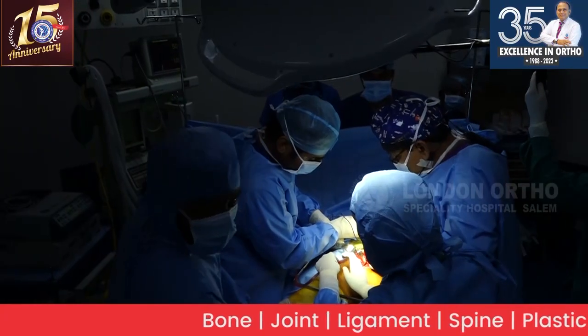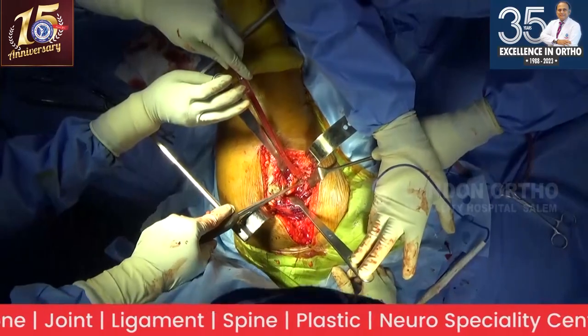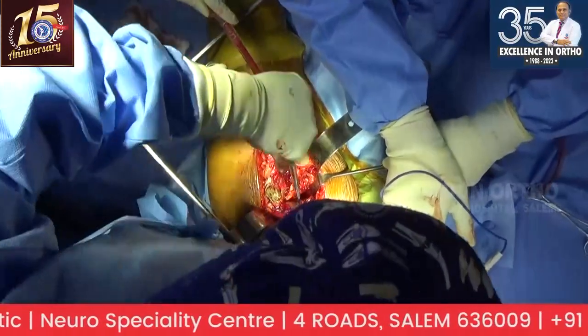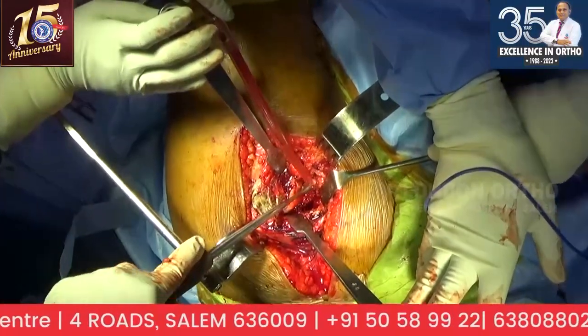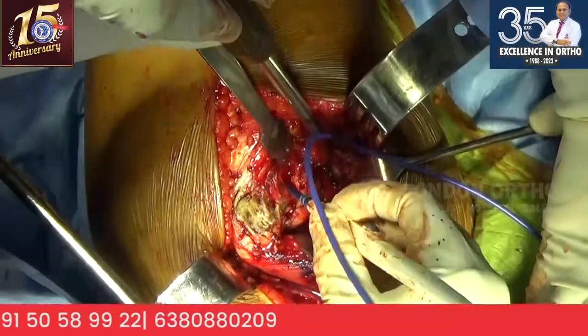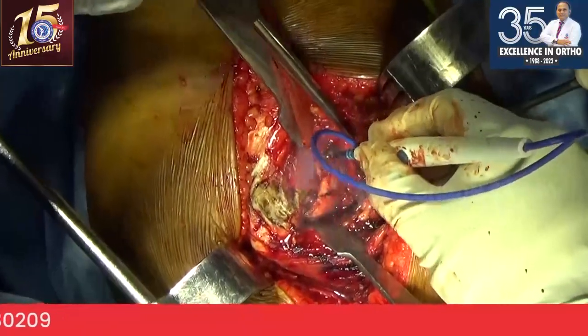So you're elevating the reflected head of the rectus femoris. Yes, and the gluteus medius also. See, this is gluteus medius. I'm on the bone, I don't want to cut the tissue. I should be able to dislocate now without difficulty. So I'm just releasing the soft tissues here. This is the inferior capsule.